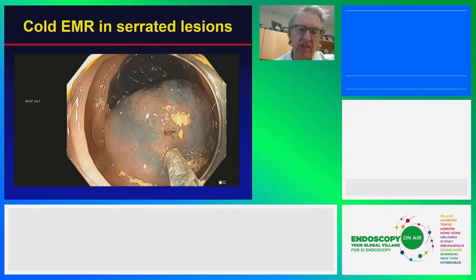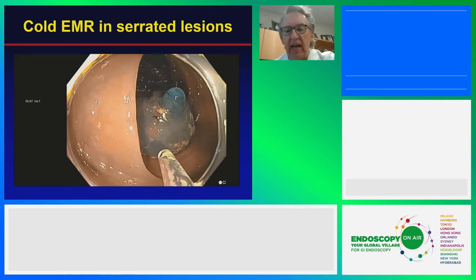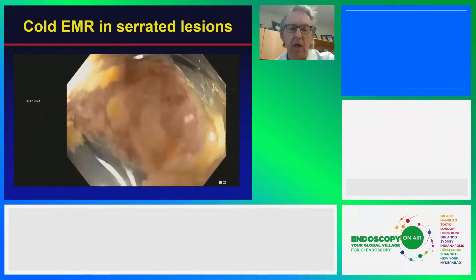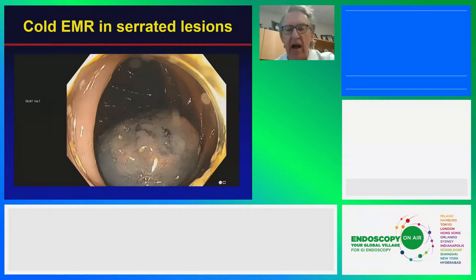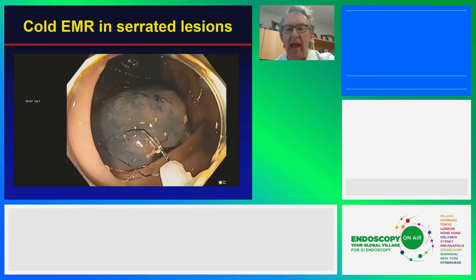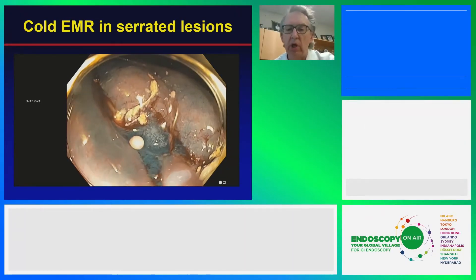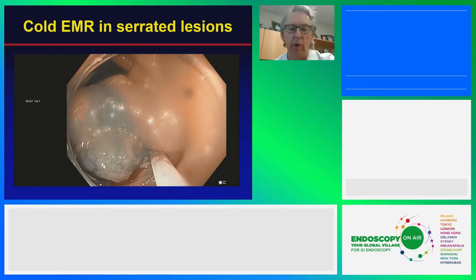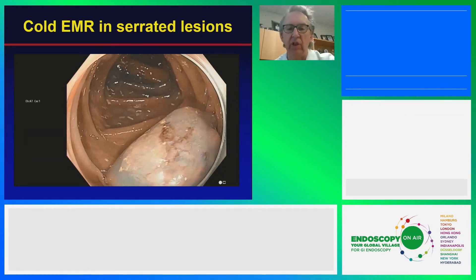We're using a diminutive snare here — this is the US Endoscopy Exacto. These snares are reduced in diameter of the braid by about a third from a typical snare, so they cut a little bit better. Even though we are going to piecemeal this lesion, it has a very high success rate. This technique is cold from beginning to end — no aspect of it is hot. Even at the end, where we would use snare tip soft coagulation if using electrocautery, we don't do that here. We just rely on a wide excision of the lesion.